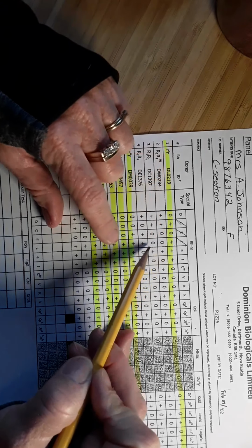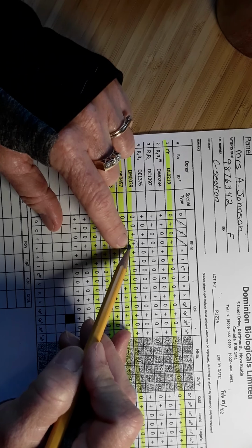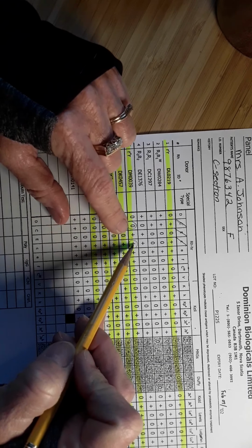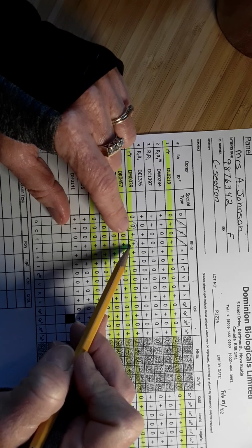Let's continue down to the other negatives. Oh, look at this. I have a little c positive cell, again, that did not react with my patient's plasma. And this time I'm a little bit happier because this is actually a homozygous little c cell. And it did not react with my patient's plasma.